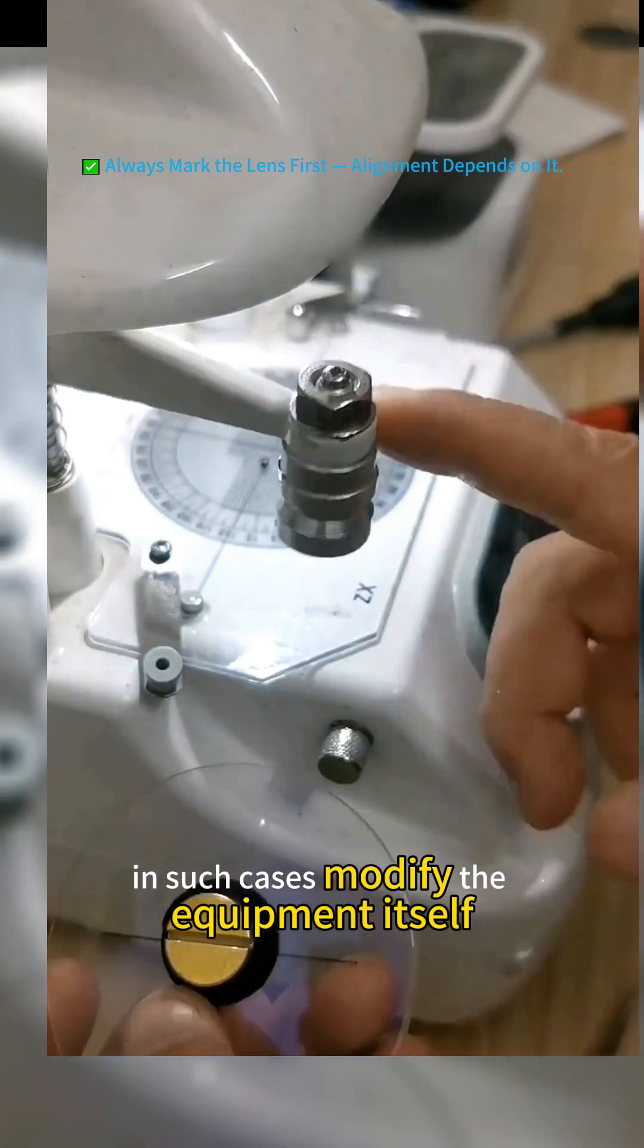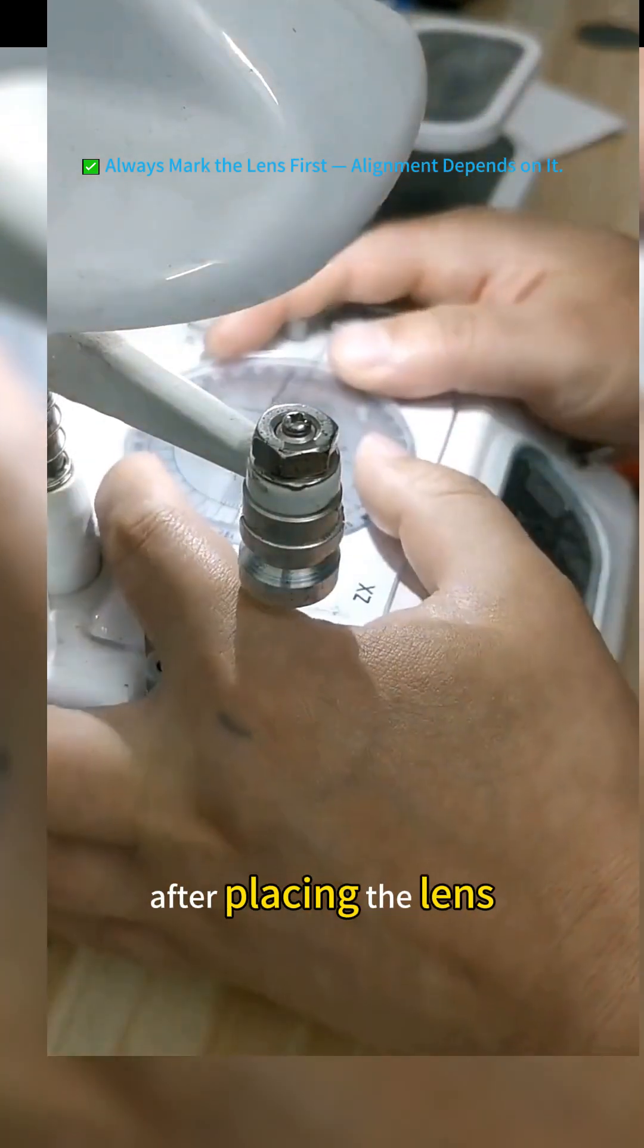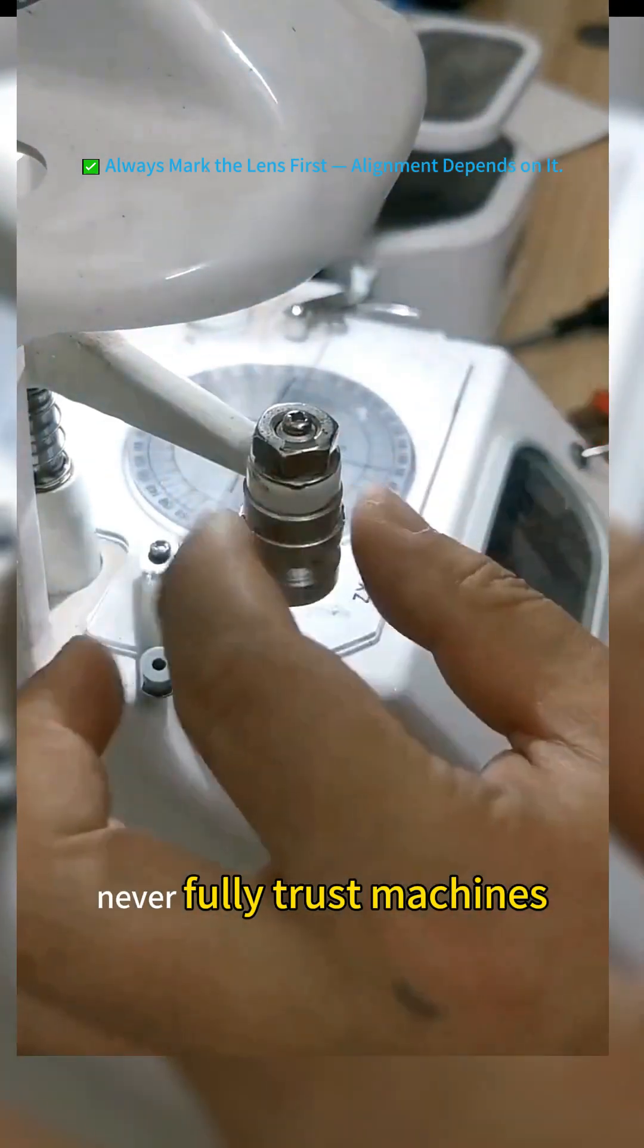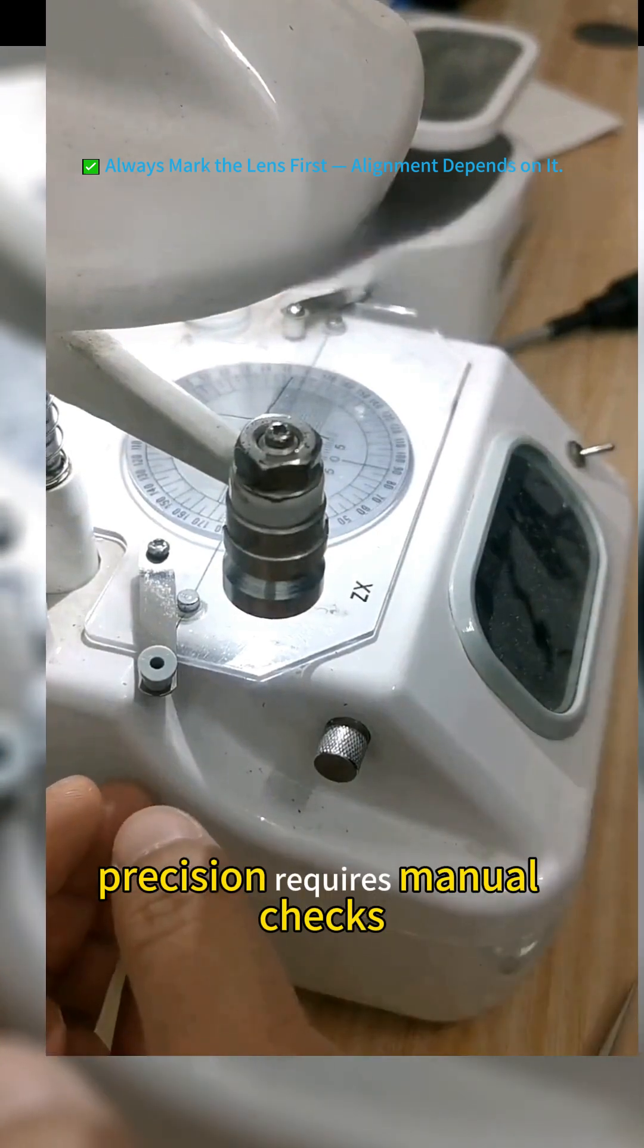In such cases, modify the equipment itself. First step remains, apply alignment markings. After placing the lens, never fully trust machines. Human oversight is key. Precision requires manual checks.